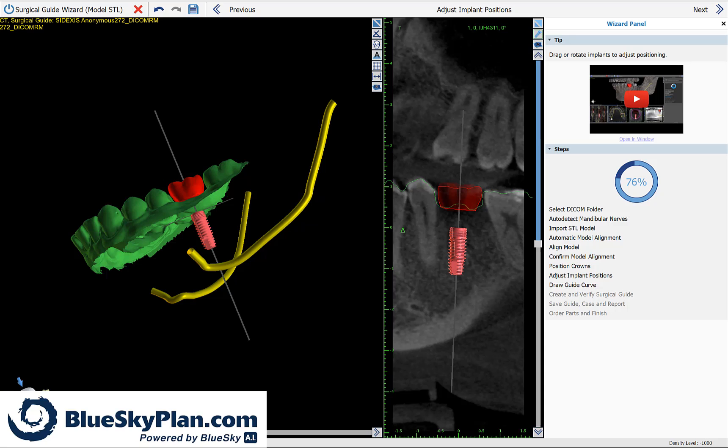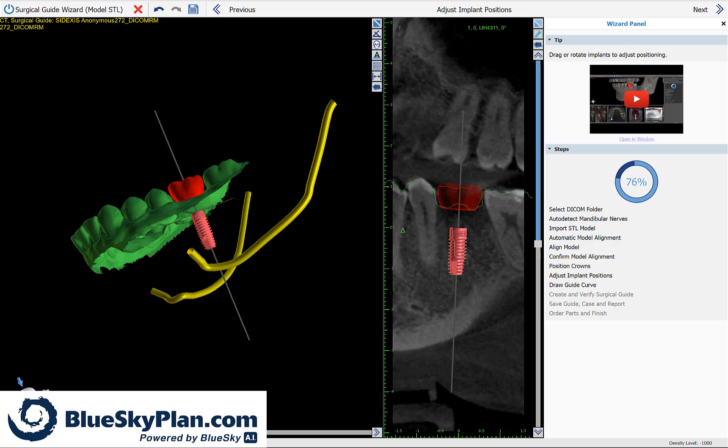Blue Sky Plan now contains AI-driven automatic implant planning. In this training tutorial I will present the almost completely automated step-by-step process flow to load the data, automatically position the implants, and create the surgical guide.